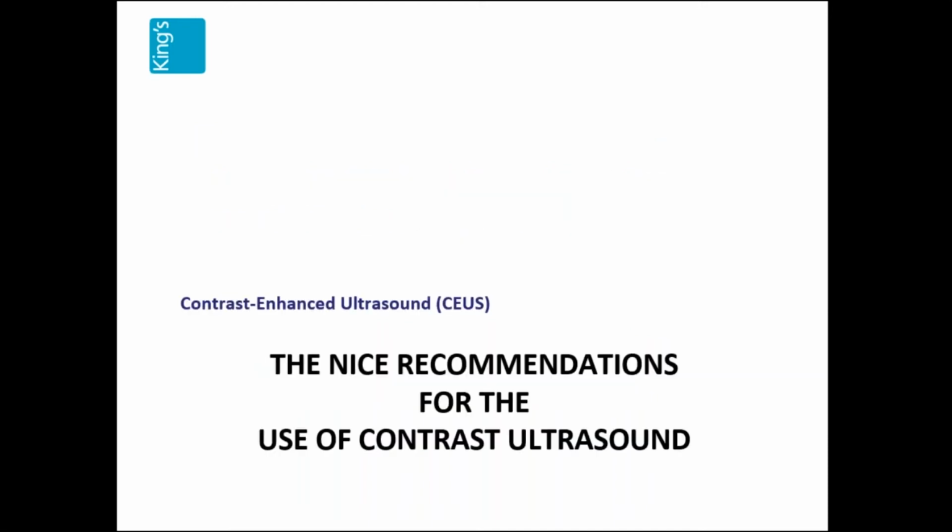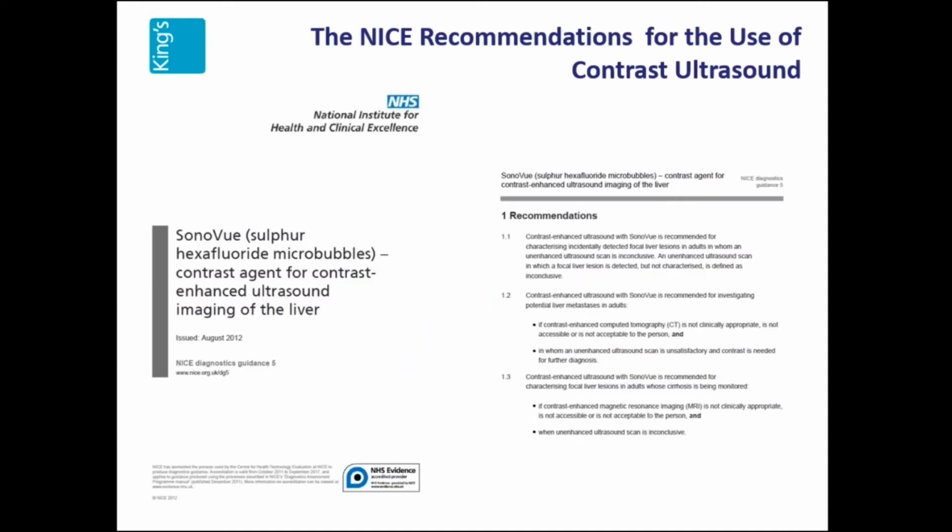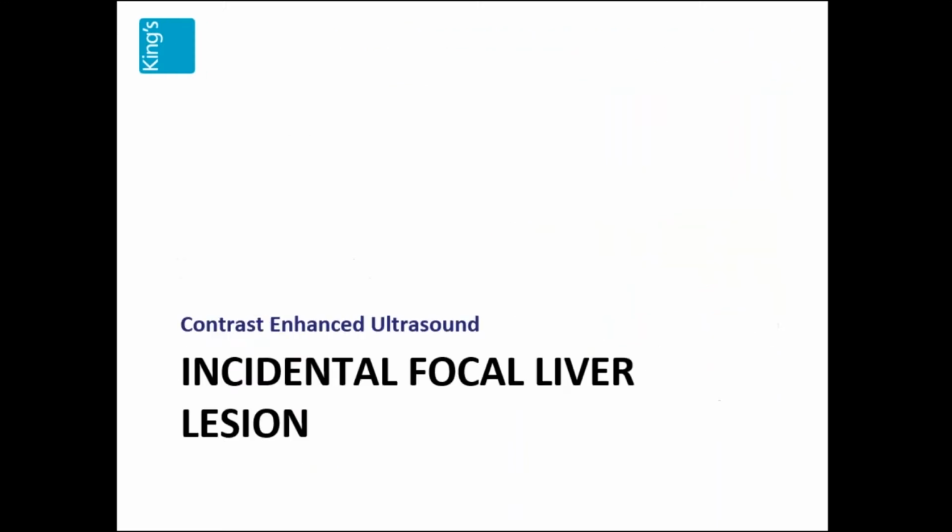In the United Kingdom, we have a group called the NICE group, which is the National Institute for Clinical Excellence, and they've looked at the use of contrast enhanced ultrasound for liver usage, and they've actually recommended, and this is important in the United Kingdom because once a recommendation is made by NICE, we're more or less obliged to follow these recommendations. And they've recommended that you use contrast enhanced ultrasound in specific areas with the liver, looking at any incidentally detected focal liver lesion that comes through your practice. Also to look at investigating a patient for potential liver metastases, and also to look at those focal lesions in liver disease. This is all what we do anyway in clinical practice, but it's backed up by an Institute for Clinical Excellence in the United Kingdom.